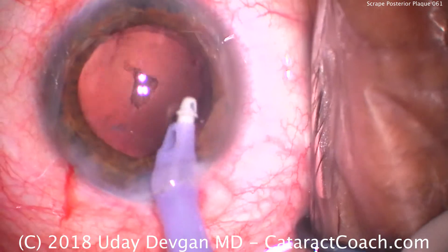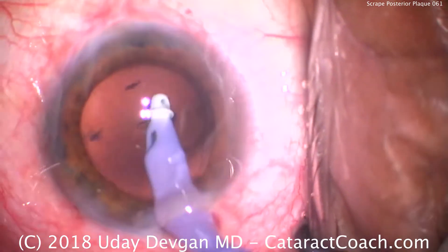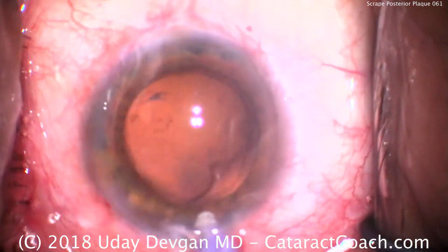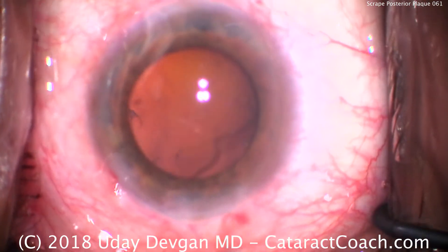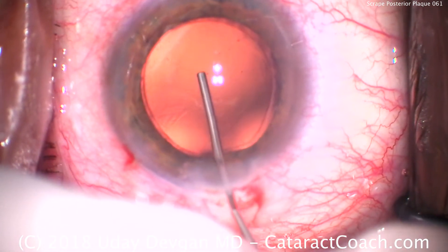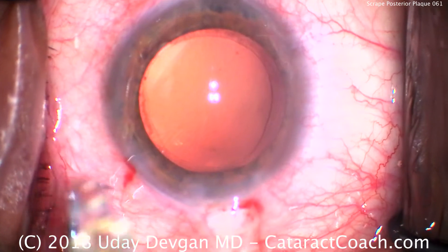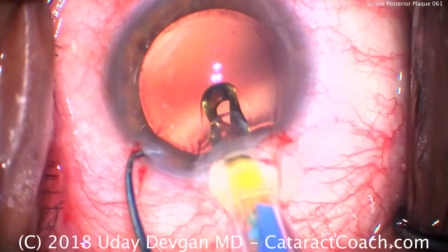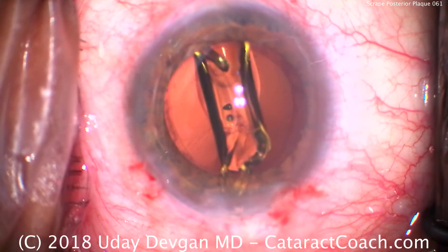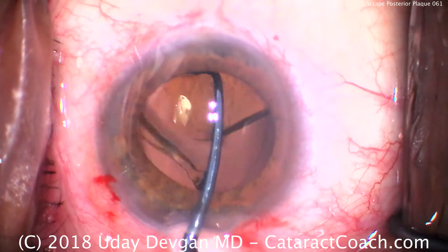I do not use capsule polishing settings to remove that plaque. Watch this: probe at the 45-degree mark, scrape it a little bit, and remove it. The foot pedal is at about half of maximum vacuum — I'm on my normal cortex removal setting. The port was at about a 45-degree angle, not facing the capsule, not facing the corneal endothelium. This allows us to remove that central plaque using the mechanical effort of the tip of the probe, touching and scraping the posterior capsule to lift up the plaque, and then the low level of vacuum wicks it down.